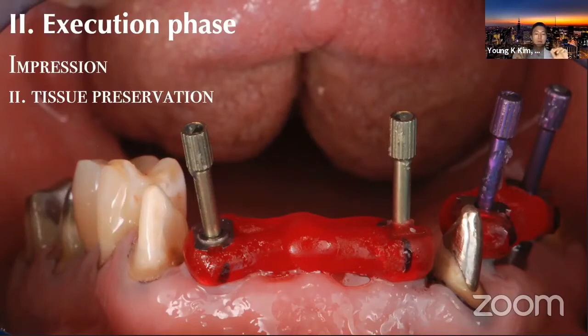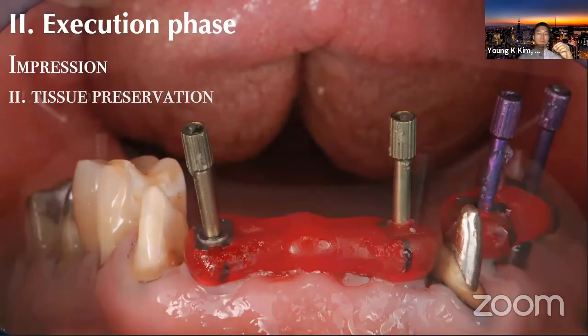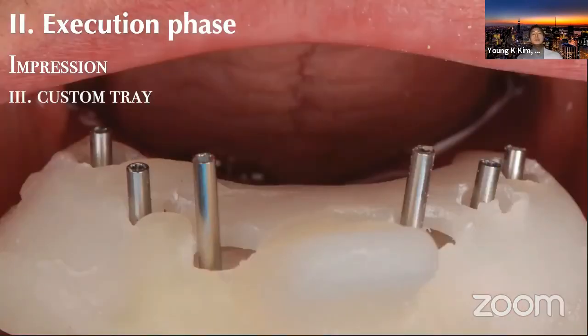So it's critical to preserve whatever information you achieved with the interim process, and you preserve that with the impression copings as well. Here I use GC Pattern Resin on the number 8 and 9 site, and some of the embrasure and emergence profile on the posterior teeth. And the custom tray fits in. You fit in the custom tray, see the passive fit, and whether the patient feels comfortable, whether it's not impinging on any sharp area. You verify and pre-fit this before taking the impression.